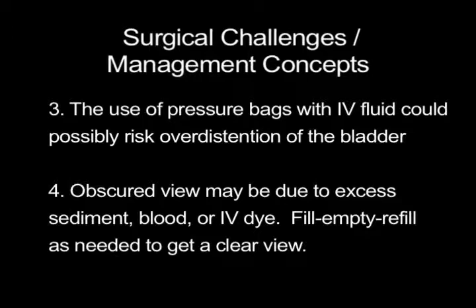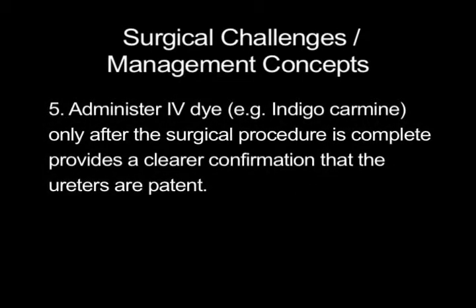Obscured views of the bladder wall itself may be due to excess sediment, blood, or IV dye. By simply filling, emptying, and refilling the bladder as needed, this will allow the surgeon to get a clearer view of the urothelium. The administration of IV dye, such as indigo carmine dye, only after the surgical procedure is complete provides a clearer confirmation that the ureters are patent compared to if having been given prior to or during the surgical procedure itself.